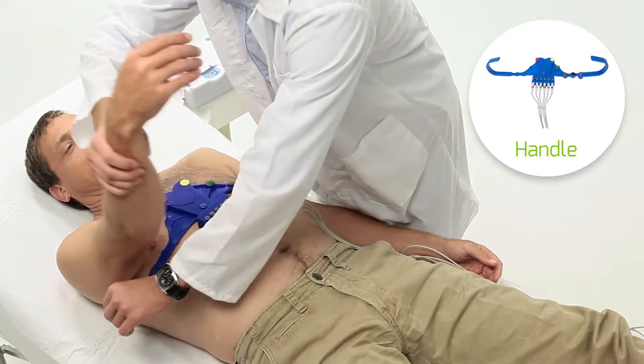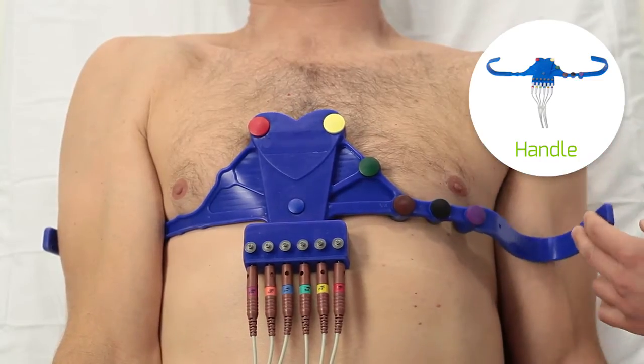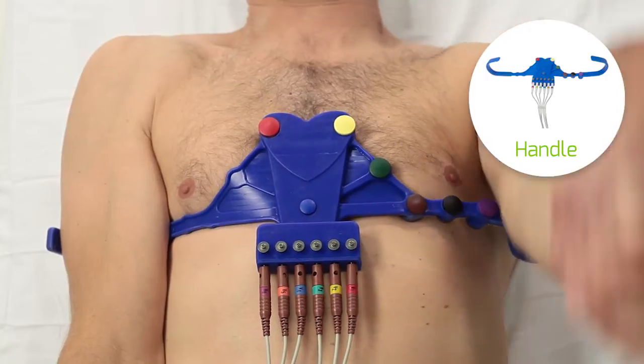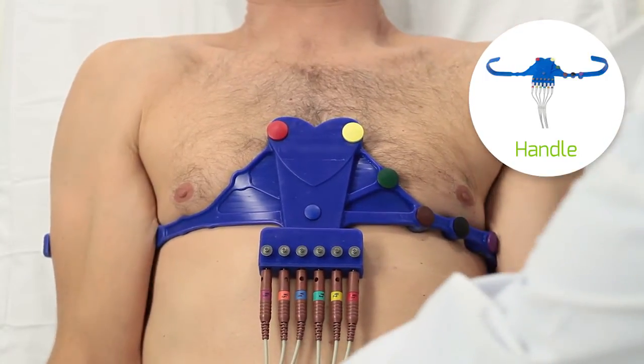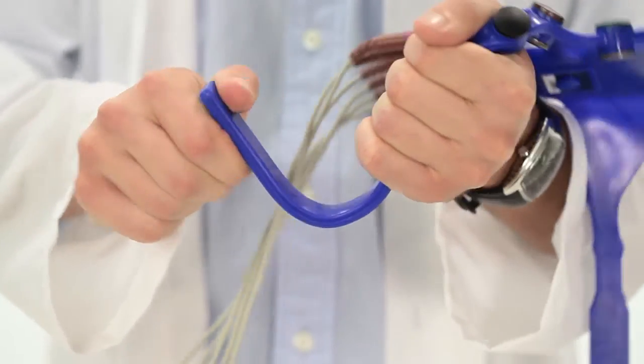If you are using the handle belt, apply the handle on the mid-arm between elbow and shoulder. If necessary, for better fitting to the arm, adjust the handle gently.